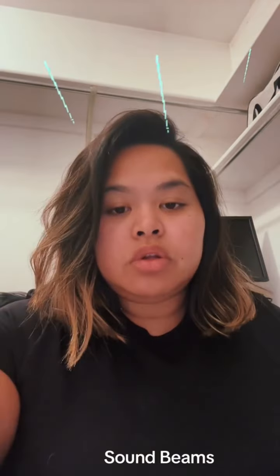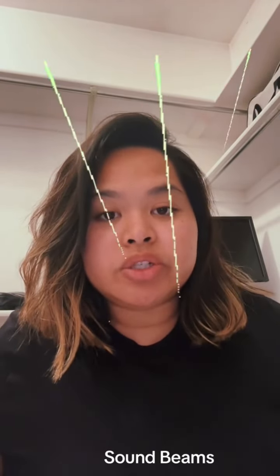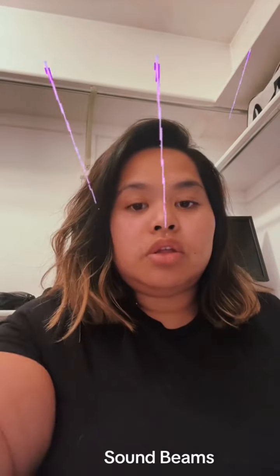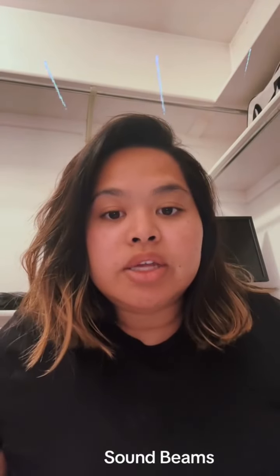Today we will be discussing sound beams. First, we will discuss zones. The first zone is the near zone, also called the Fresnel zone. This is where the transducer reaches to the focus. Here the beam gradually narrows or converges until it reaches the focal point.